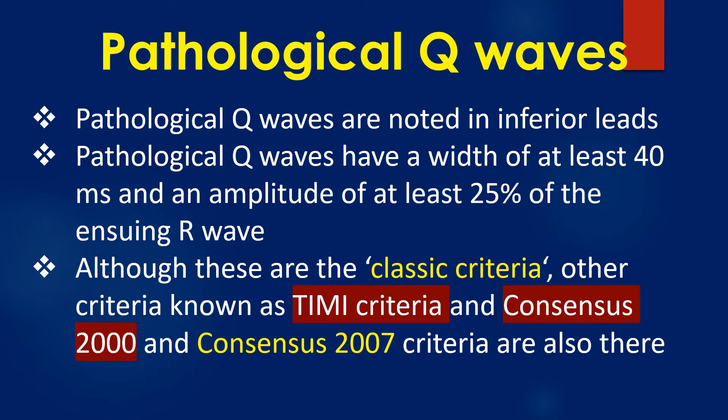Pathological Q waves are noted in inferior leads 2, 3, and AVF. Pathological Q waves have a width of at least 40 ms and an amplitude of at least 25% of the ensuing R wave. Although these are the classic criteria, other criteria — known as TIMI, Consensus 2000, and Consensus 2007 — also exist.